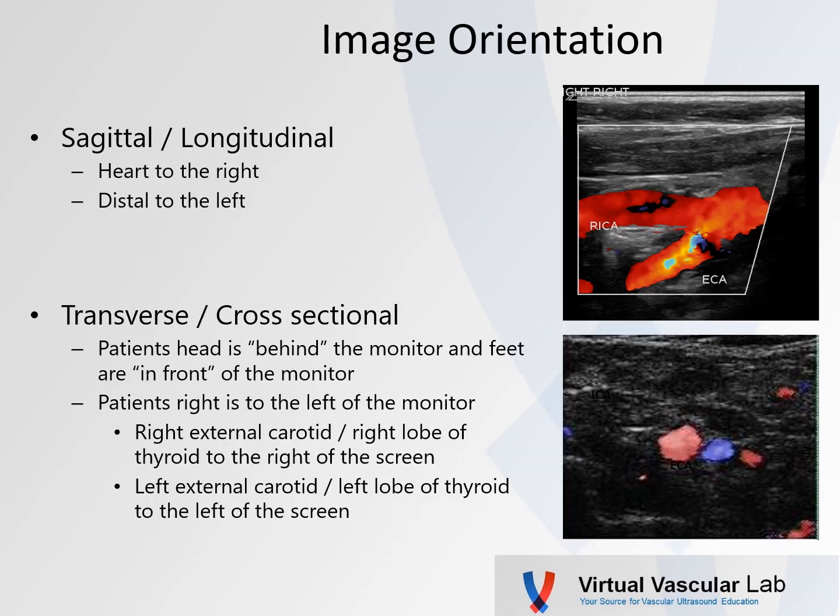So let's start off with image orientation. In a sagittal or longitudinal view, it's pretty straightforward: the heart is to the right of the image and the distal vessel is to the left.